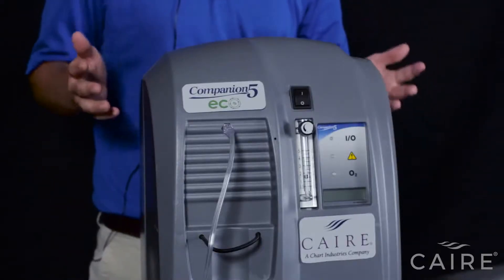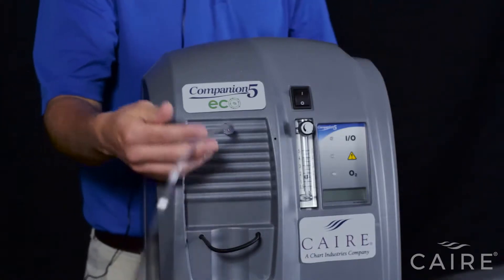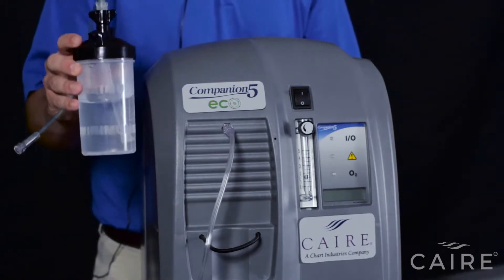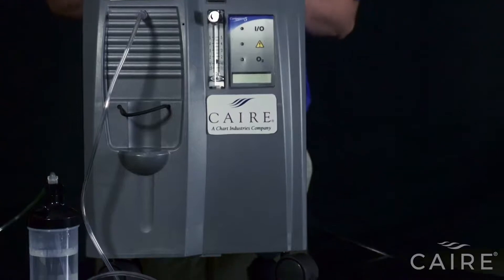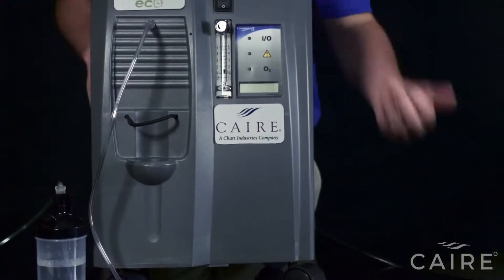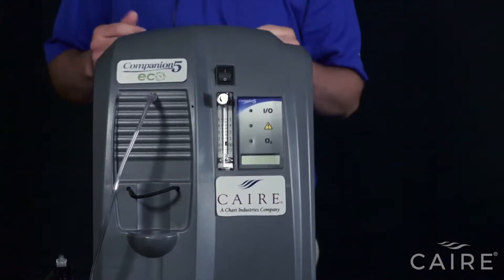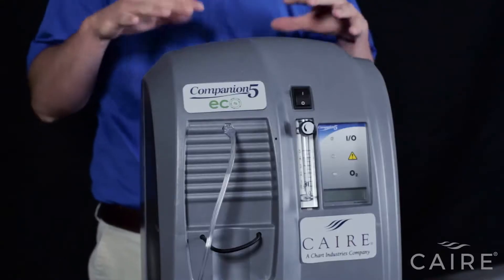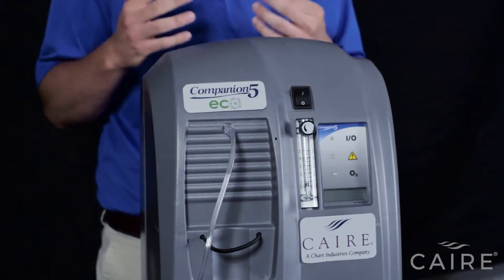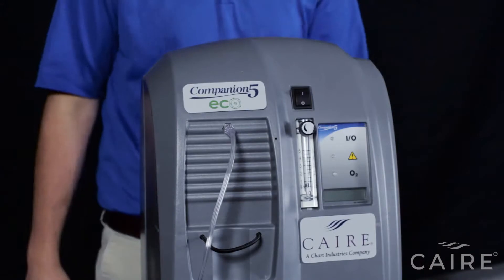Maintenance on the Companion 5 for the patient or user is actually very easy. You will want to make sure that you change your tubing or refill your humidifier bottle as instructed by your equipment provider. Air enters the machine in two different places: the air that you eventually breathe enters through the bottom of the machine where there is a filter, and air used for cooling enters through the vents on the back. When you set the machine up, make sure that neither of those places are obstructed — keep it about a foot away from all walls, curtains, furniture, or anything like that to ensure proper airflow.